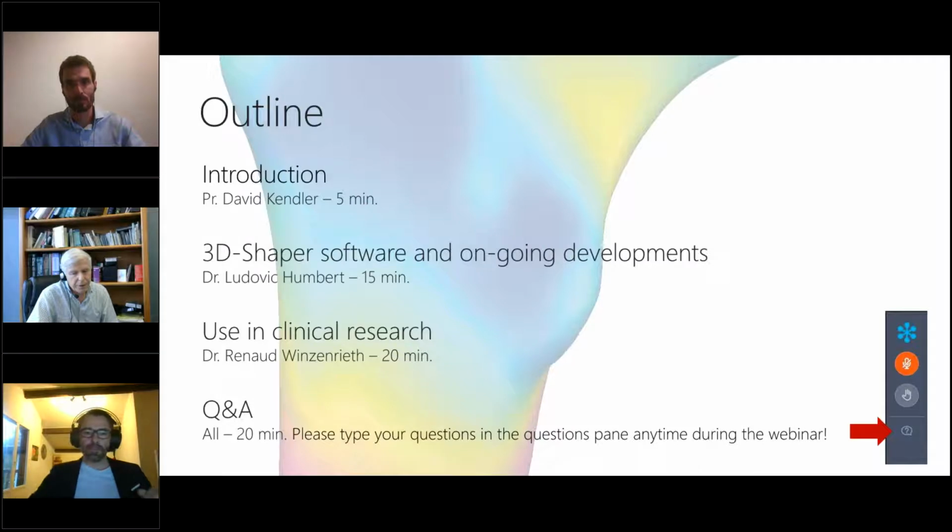We also know that there's a recent initiative headed by Dennis Black called FNIH to develop changes in hip areal bone density as being a surrogate for anti-fracture efficacy, perhaps in the future precluding the need for fracture endpoint studies. So the focus on hip bone density has certainly become more acute with the FNIH initiative.